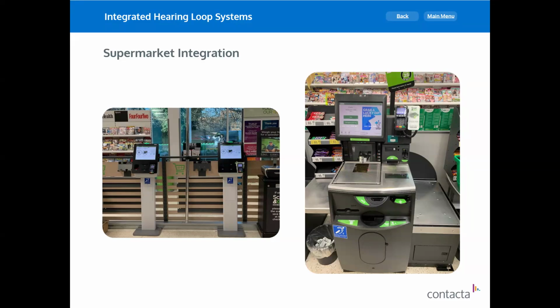Obviously everyone on this call knows the challenges, or the cons, of hearing loops: metal content, EMI, background noise. We can't install a hearing loop underneath this tray here because it's all stainless steel, obviously. So where the loops are installed, typically in these kinds of positions, we are installing a loop aerial behind the screen. We would take the screen apart or work with the manufacturer of the screen, and we'll put the aerial behind the screen. Because remember, this is a plastic frame, the screen is glass or plastic. So that's not a problem for the loop. The loop has no impact on anything else here.